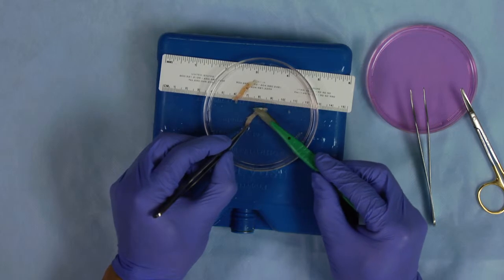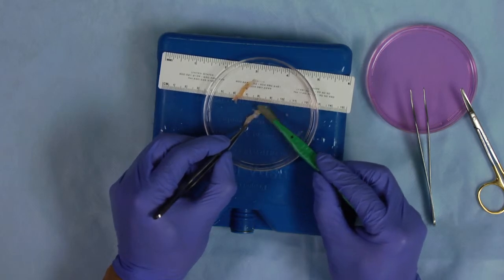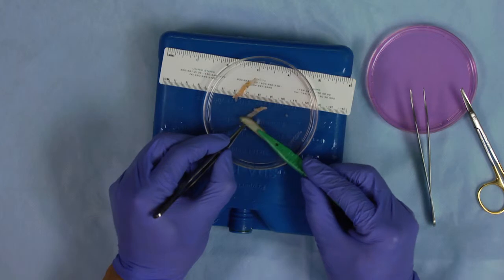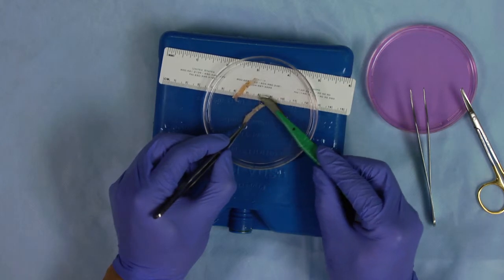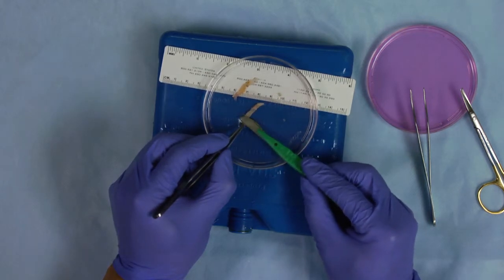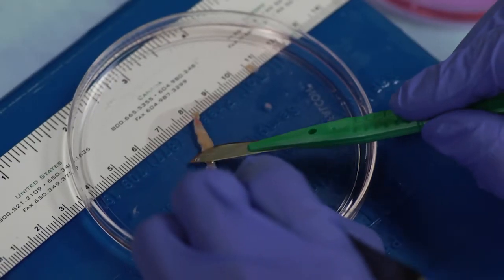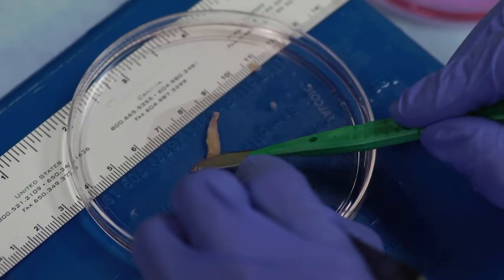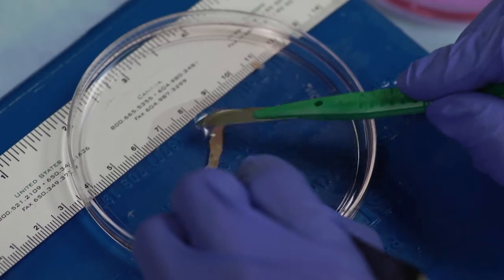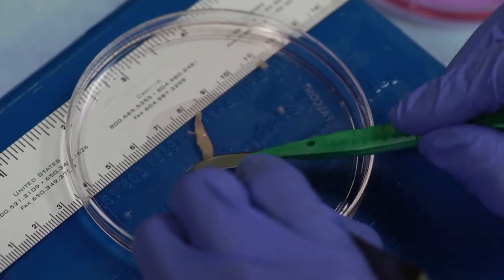From personal experience, a curved scissor usually is enough to trim ovaries from patients who are teenagers or younger down to one millimeter, while a number 10 scalpel is used mostly to thin the cortex for patients who are older. All human ovaries are unique. The age of the patient can vastly influence the time it takes for dissection and the tools that are used.